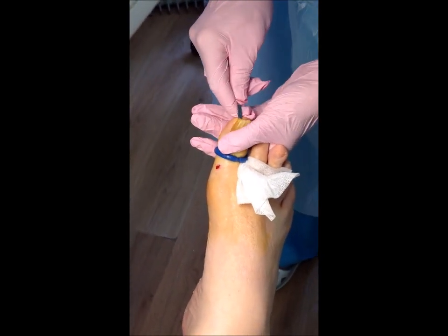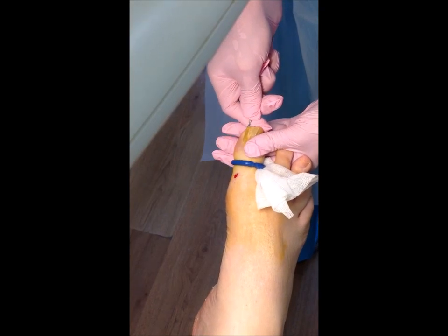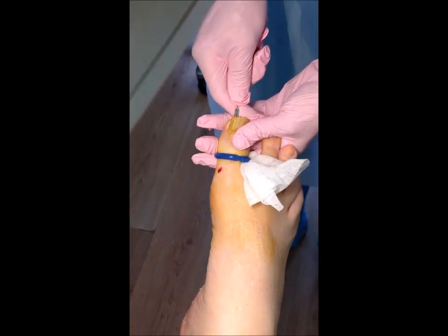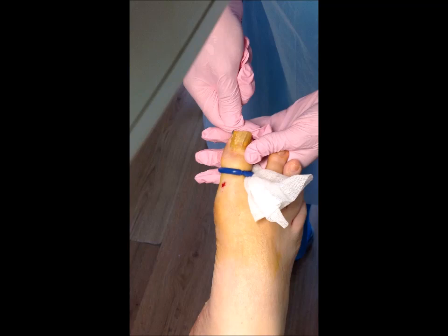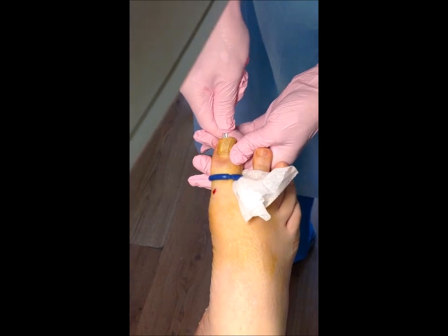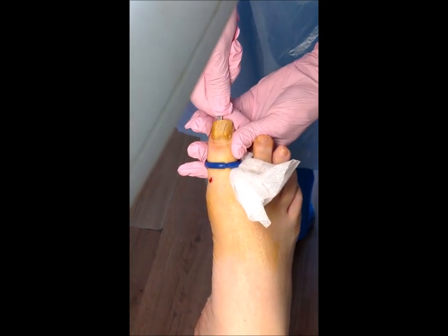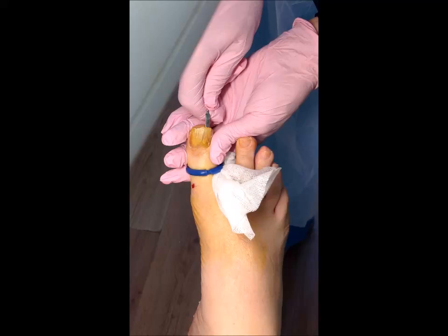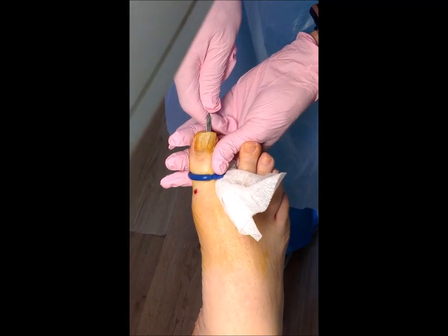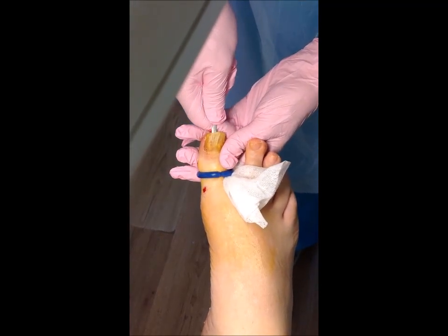It's all nice and loose, and then I just need to get underneath there. This is removing very, very easily — you can see I'm not straining to do this. One of the reasons it is so easy to remove is because it's so diseased, although sometimes you can get nails where the nail bed is so damaged underneath that you're actually going against a lot of fibrous scar tissue. I'm now just going to release the other side — can you feel anything? Just a little bit of pressure?